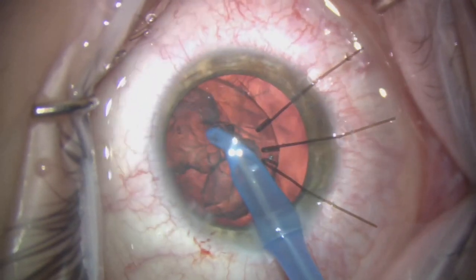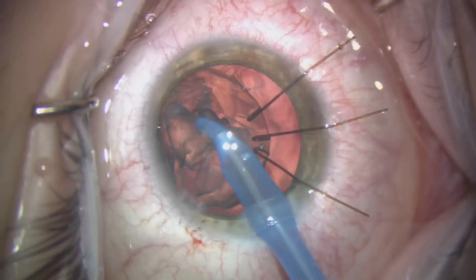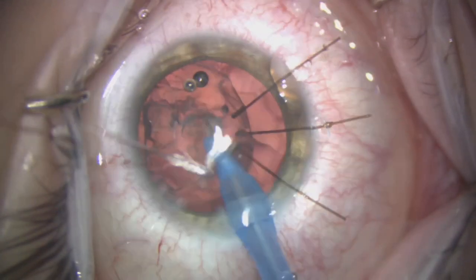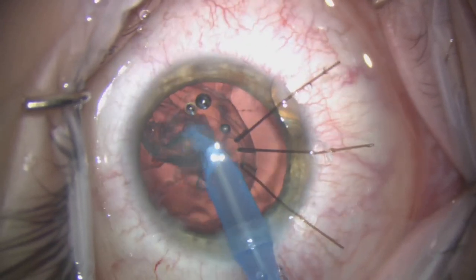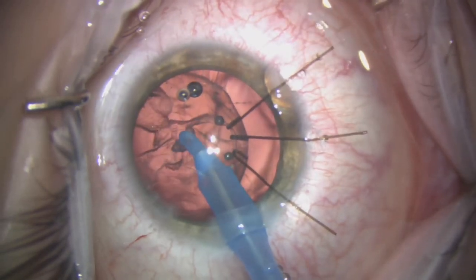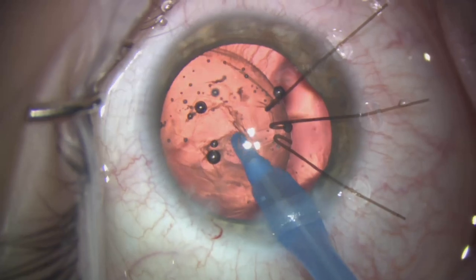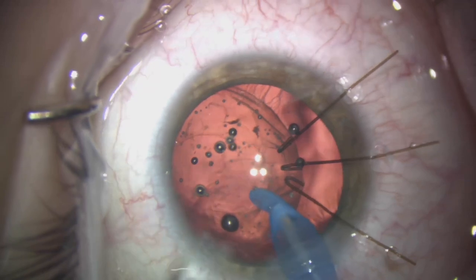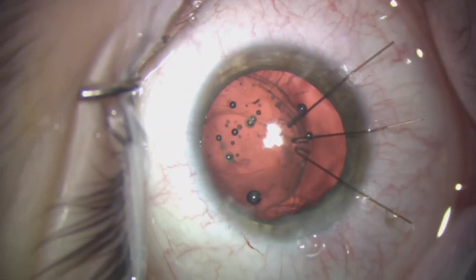Once we've completed removal of the central nuclear remnant, the remainder of the cortex can also easily be removed using the I/A handpiece. The main caveat is to use low flow settings and low levels of vacuum to ensure absolute control within the anterior segment. Before we remove the I/A handpiece we fill the eye with some viscoelastic — you can see the bag is nice and clear.